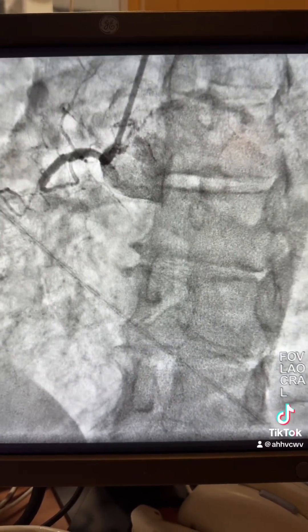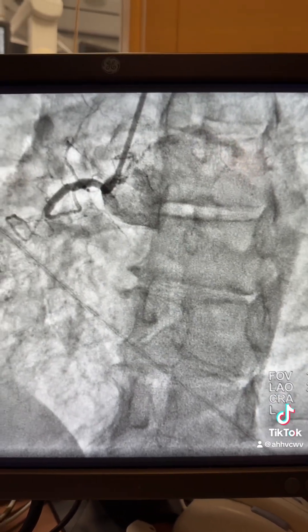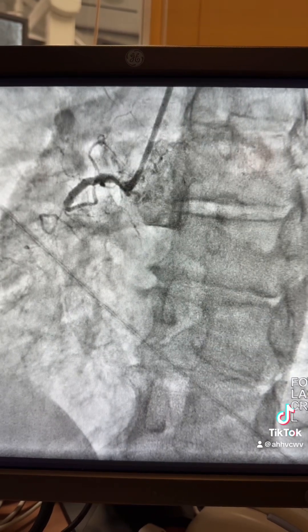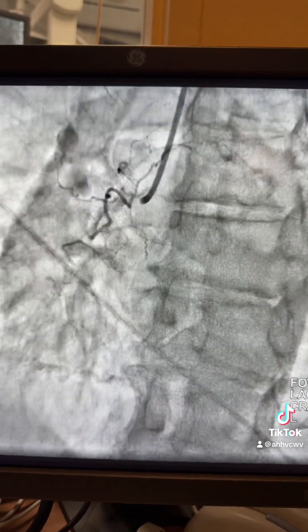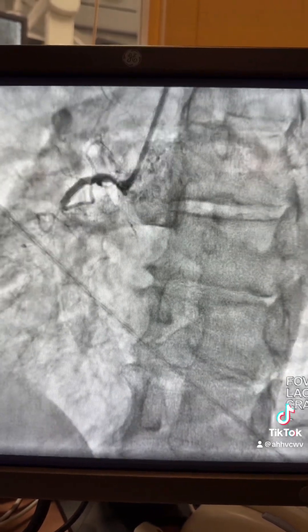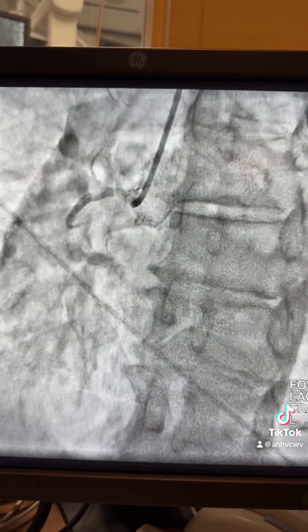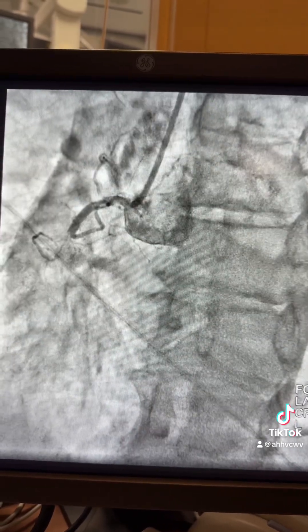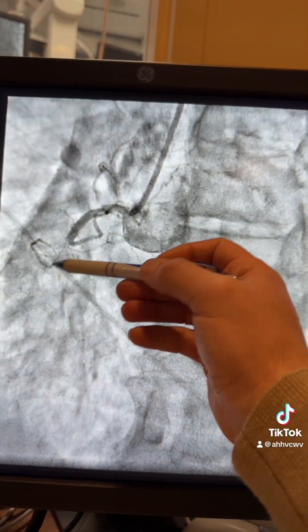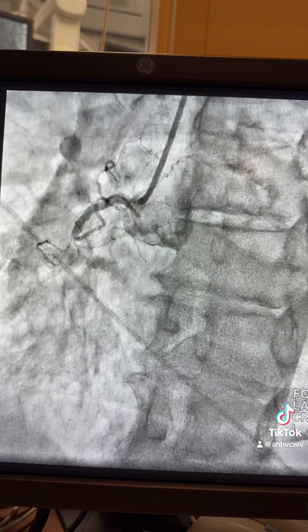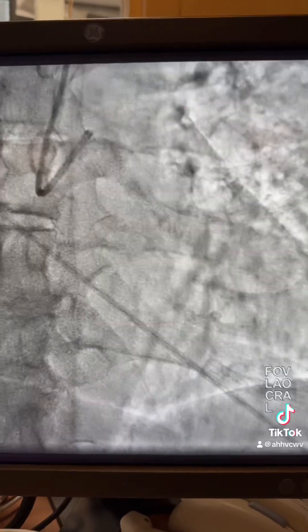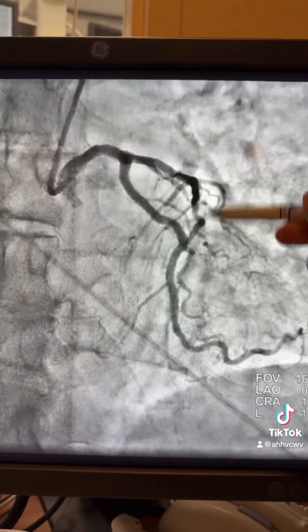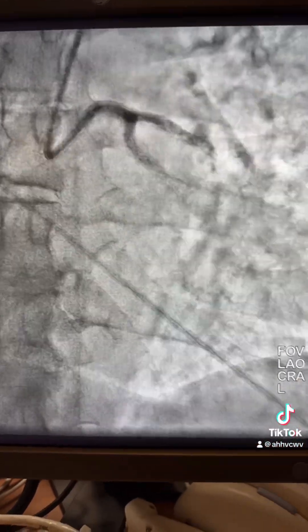Good evening. Today we're going to discuss this CTO RCA from radial access, going step by step from wiring to ballooning. This is the first angiogram — you can see the blunted cap, and what made it a little difficult is two branches coming off, neither going to the true lumen. The left side angiogram is okay; there are stents in the circumflex, moderate lesions in the LAD, and collaterals toward the RCA.